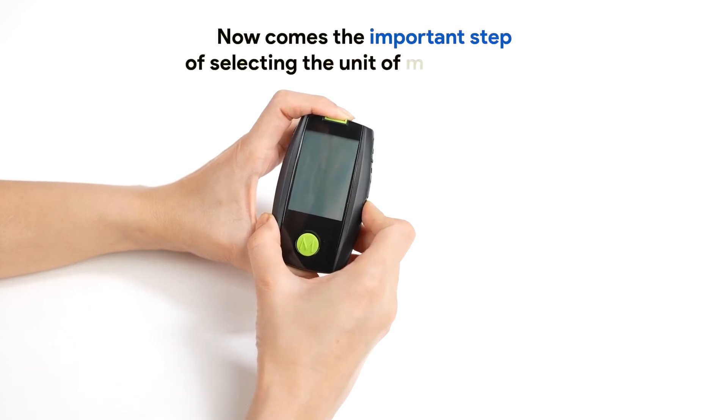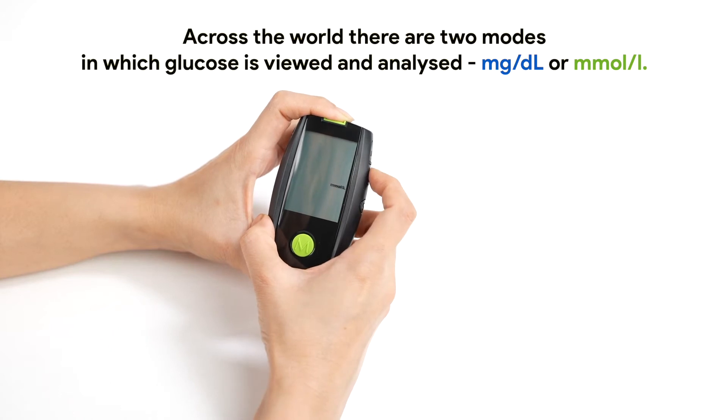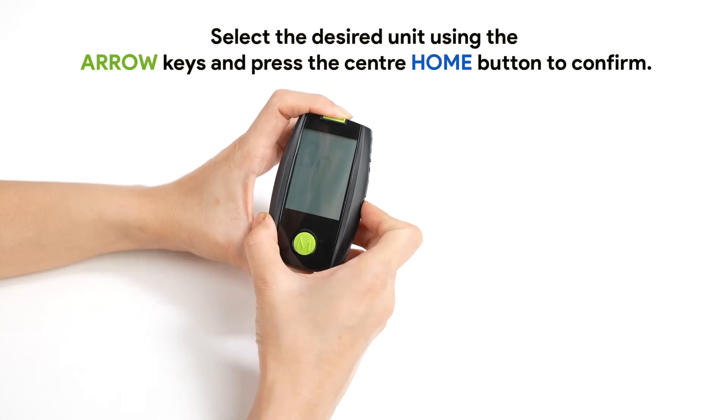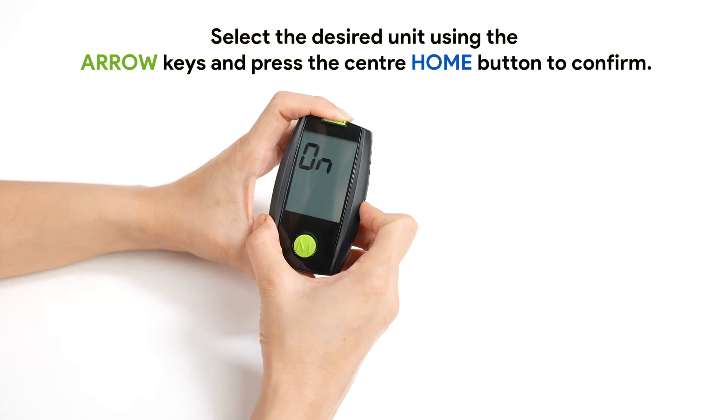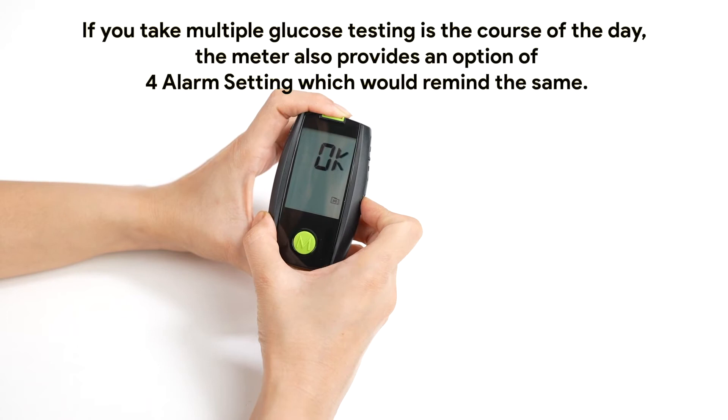Now comes the important step of selecting the unit of measurement. Across the world, there are two modes in which glucose is viewed and analyzed: MG per DL or MMOL per L. In India, the most preferred option is MG per DL. Select the desired unit using the arrow keys and press the center home button to confirm. If you take multiple glucose tests in the course of the day, the meter also provides an option of four alarm settings which would remind you of the same.